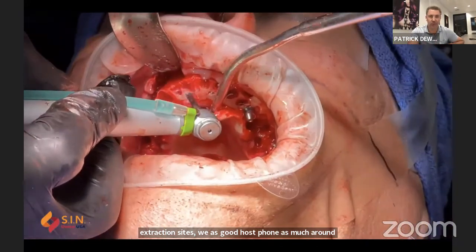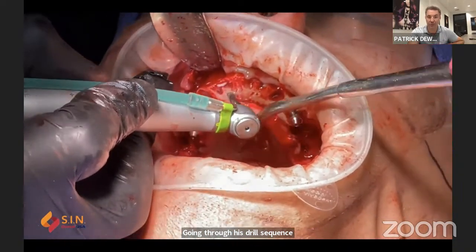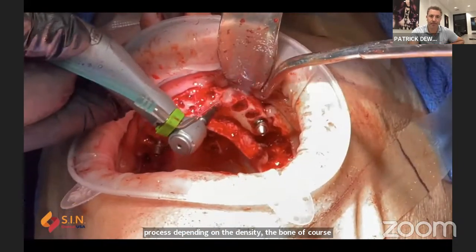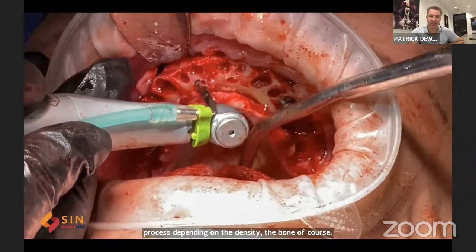Going through his drill sequence, and it's very simple. It's usually a 2 to 3 drill process, depending on the density of the bone, of course. And here gives you a good visual of the angulation.